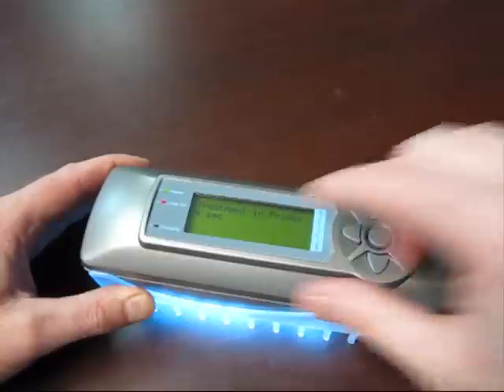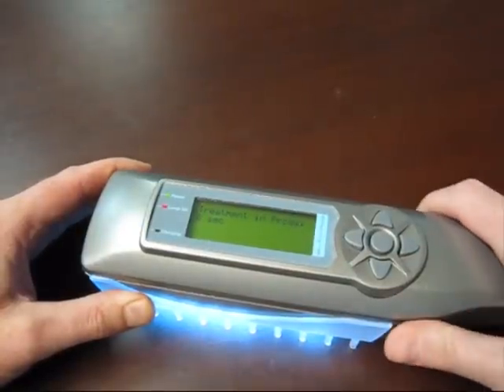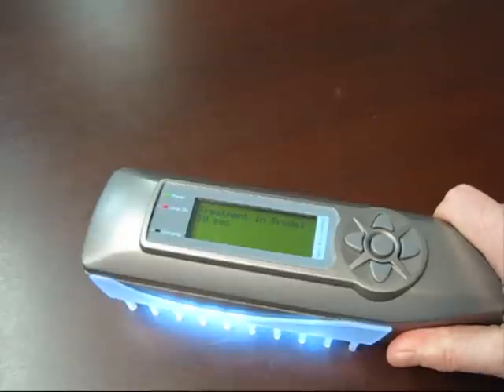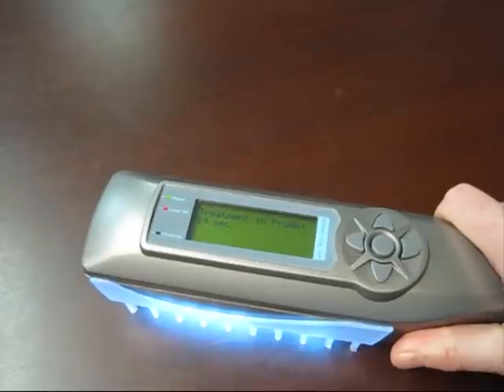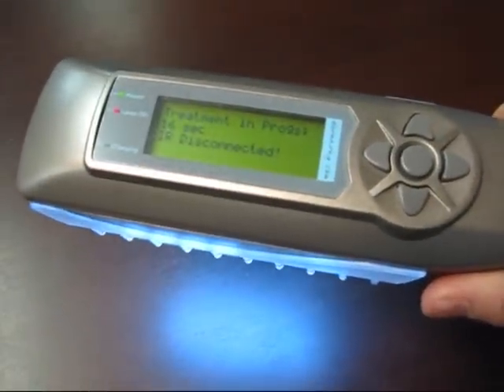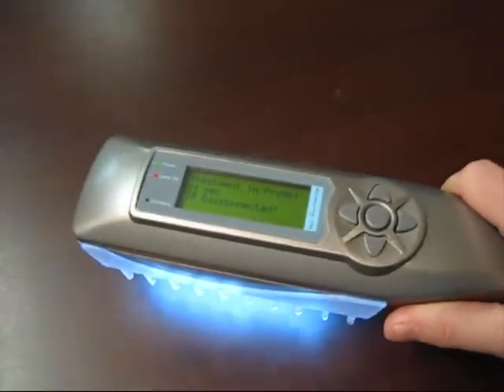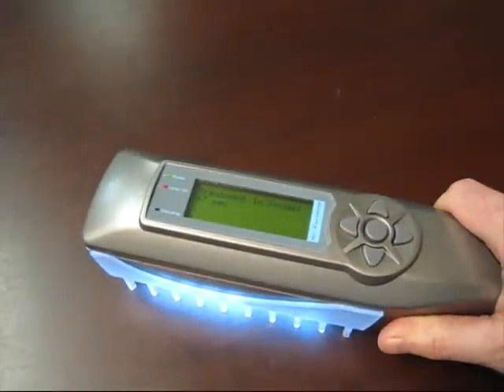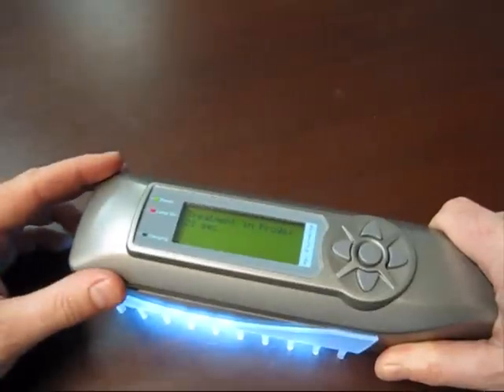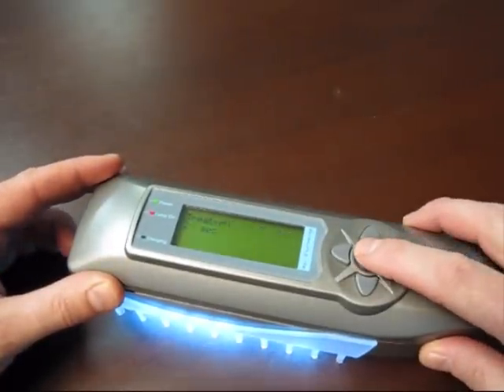Now you notice the timer is counting seconds. It's going to stay on until we turn it off in this mode. Just to demonstrate how the proximity detection system works, if we move it away from a treatment area, it'll indicate that it's lost the connection and stop the timer. If you go back to a treatment area, it'll detect that you're on the treatment area and start the timer again. To end this mode, you need to do that manually by pressing the enter key.